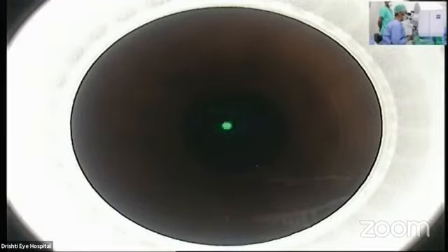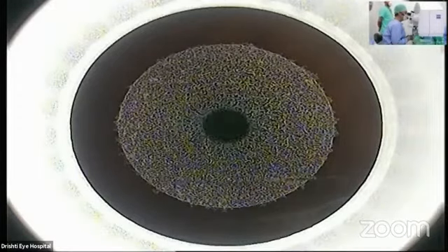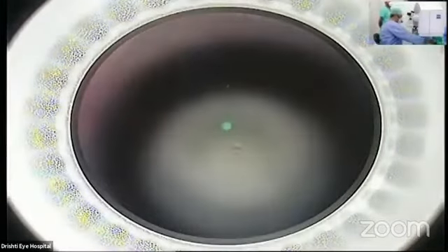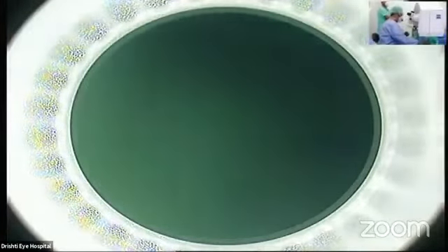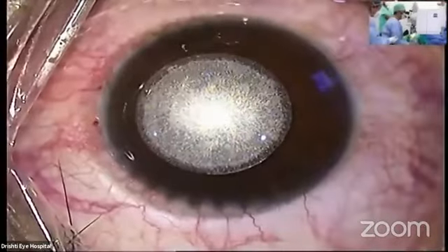I am counting till 20 now. Please keep watching the small green light and relax. 1, 2, 3, 4, 5, 6, 7, 8, 9, 10. Now you won't see the green light — remain relaxed, keep both eyes open and keep looking straight up. 11, 12, 13, 14, 15, 16, 17, 18, 19, 20. That is the ablation done. We are using a port of 2 millimeters. I used to use a 4 mm side cut when I started, and we used a 6.3 millimeter optical zone with a 7.3 total zone for this patient. Now you have to look into the light.